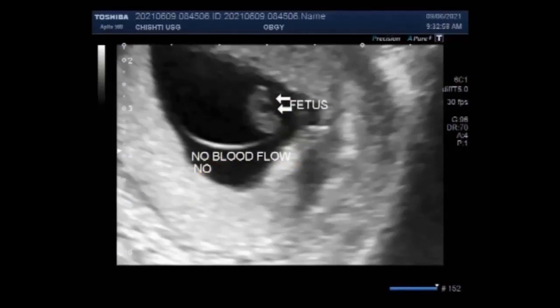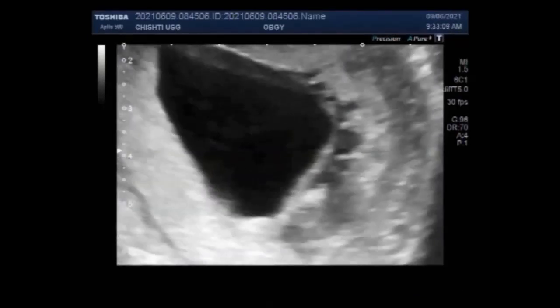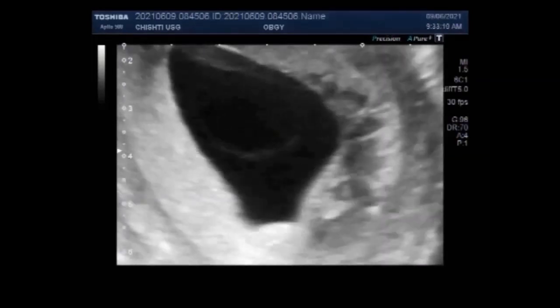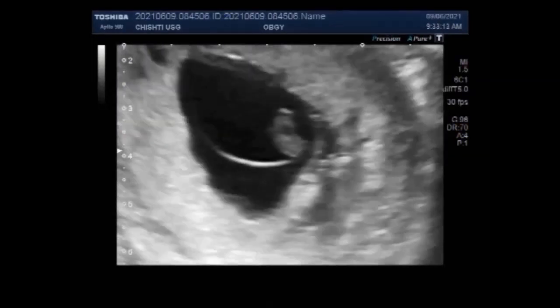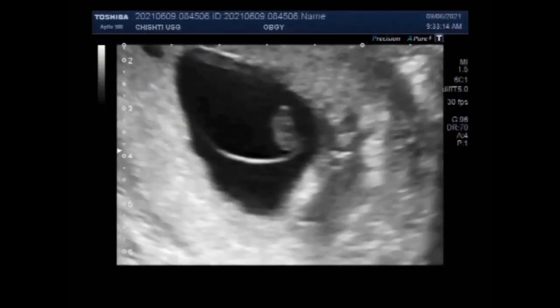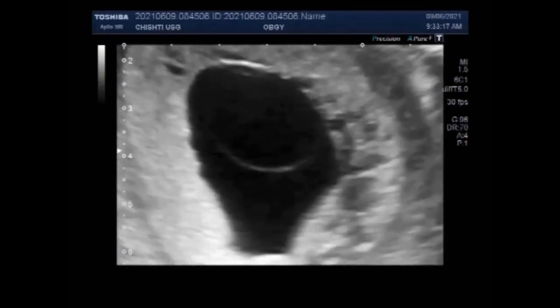Because the blighted ovum still makes hormones, it can show up as a positive pregnancy test. A blighted ovum will cause a miscarriage usually at 7 to 12 weeks of pregnancy. As in this case, the duration of the pregnancy measures slightly more than 8 weeks.